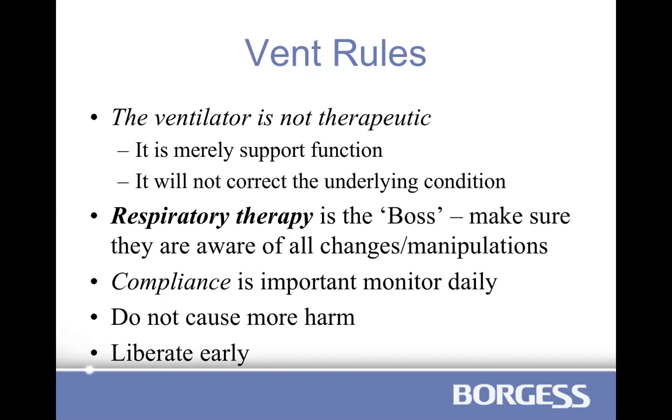Also, respiratory therapists, they are the boss. So when you make changes, when you want to do anything to the ventilator, make sure they are aware. Obviously, there are more ventilators than there are respiratory therapists, so they can't be present at every ventilator at every minute. But if you are going to make some changes or you have questions, please include them. They are the ones ultimately responsible for the machine.